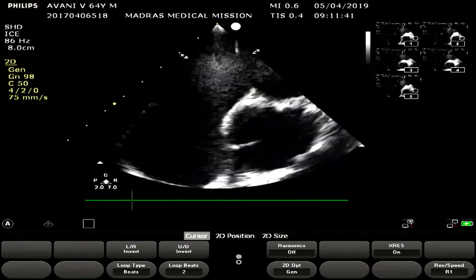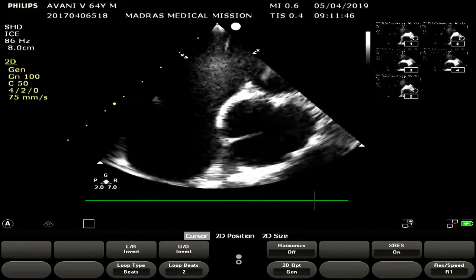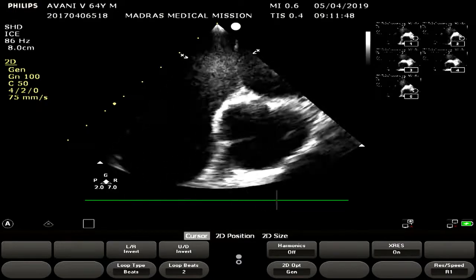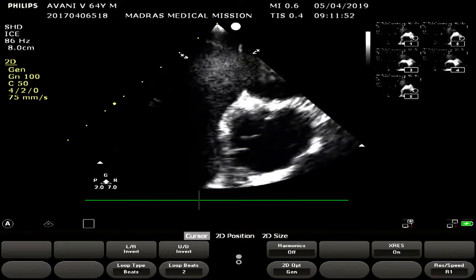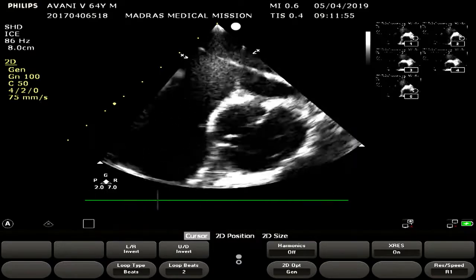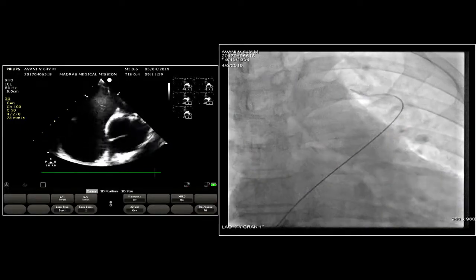2.8. Yes, sir. So we have a right coronary catheter which has gone into the left upper pulmonary vein, and we will be putting in an 11 French sheath. You are saying? Can we see picture in picture with the fluoro? Yeah. Please show.